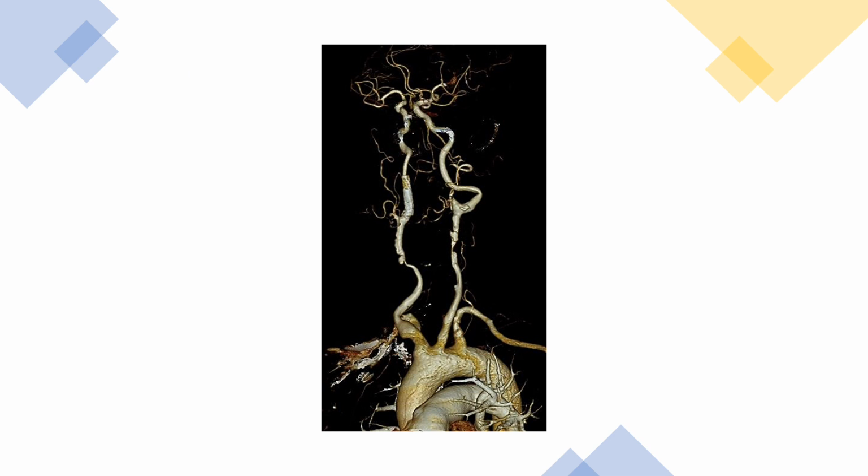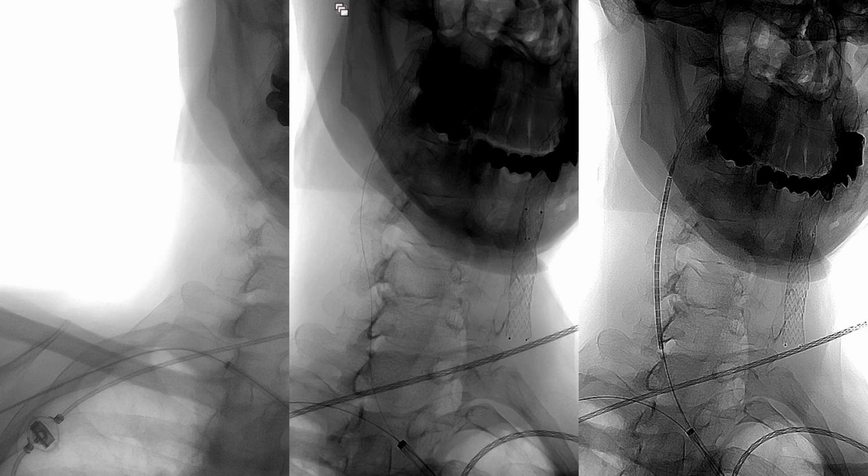The problem was we had a stenosis coming all the way here. Now imagine in such a situation, again, you'll have the same problem. You want to put a stent, you want to keep a long sheath down here. If you do not have an anchor on the other side, it's very possible that this long sheath will pop out. Have a look at what we're talking about.